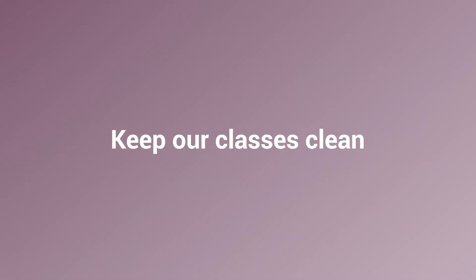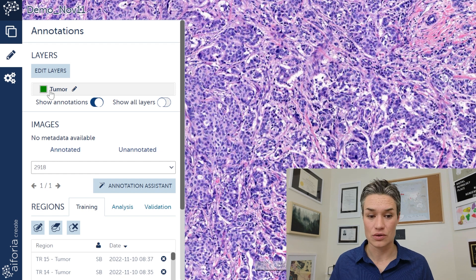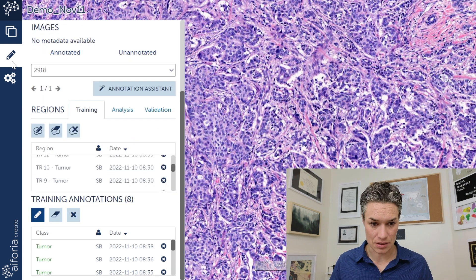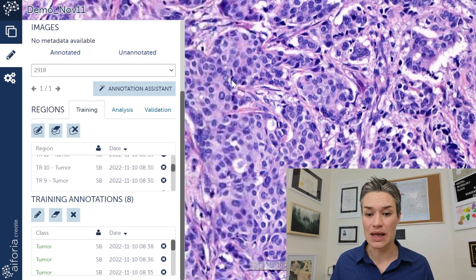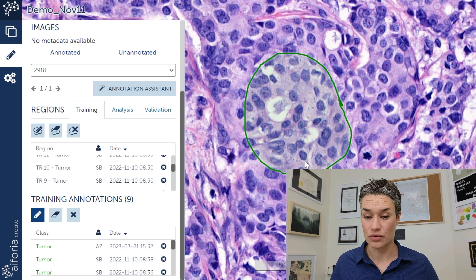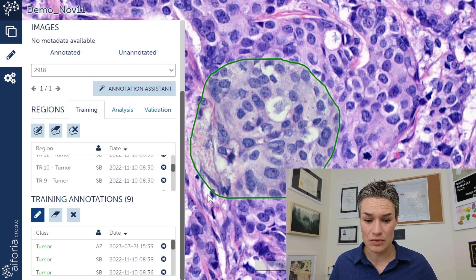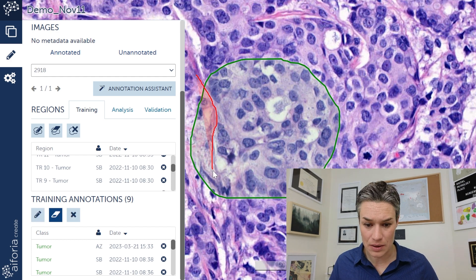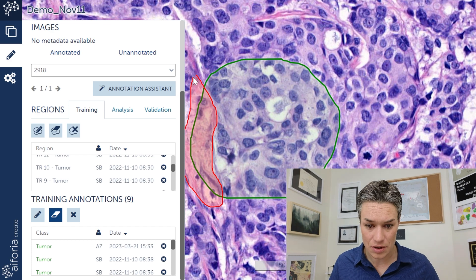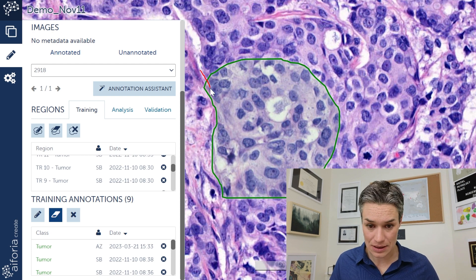The second thing we need to do is keep our classes clean. Currently we just have one class: tumor. Keeping a class clean means I only include pixels belonging to that class in my annotation. I annotate like this to include the tumor — not like this, where I'm taking stroma into my tumor annotation. We don't do that, because then our model is going to be confused.